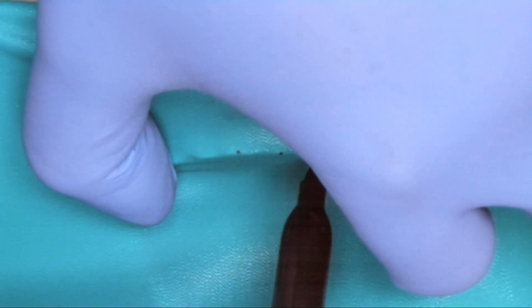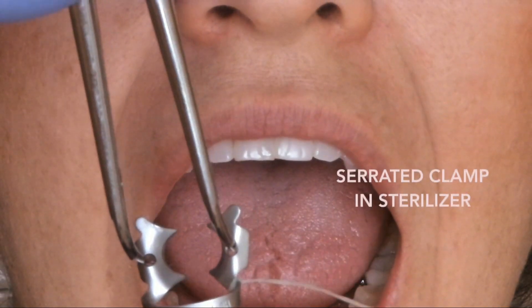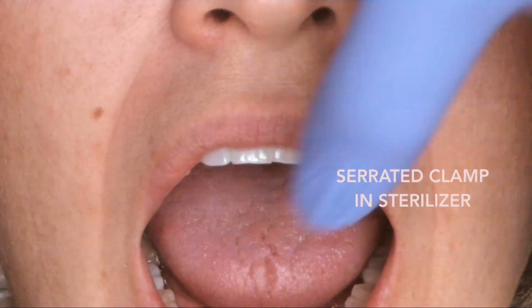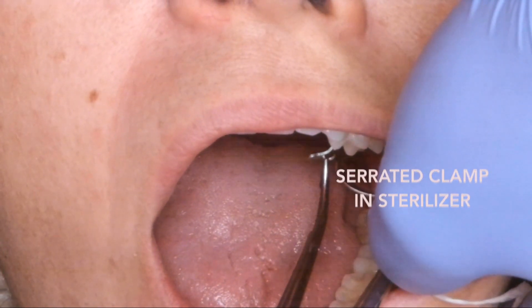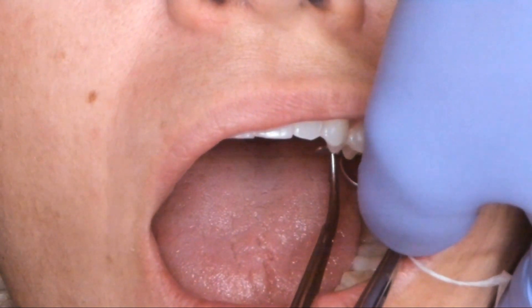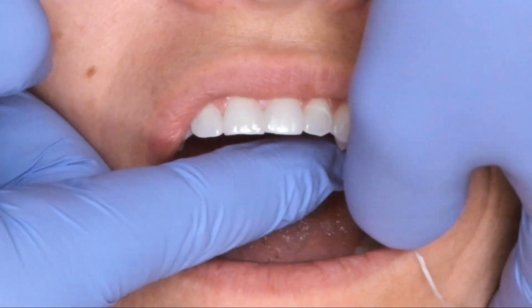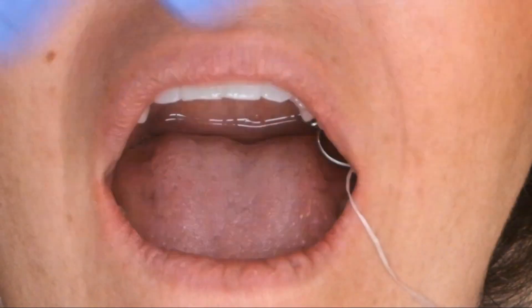This is done after giving local anesthesia so that our patients have some time to get profoundly numb. All we have to do now is deliver the clamp to the tooth and place the rubber dam on. When placing the clamp, I make sure to slowly maneuver over the height of contour and to be extra careful of the gums. Patients will feel no pain if the clamp is placed entirely over the tooth surface. After placing the clamp, I make sure it is stable and in the correct position. The floss gives me the ability to retrieve the clamp at any time.